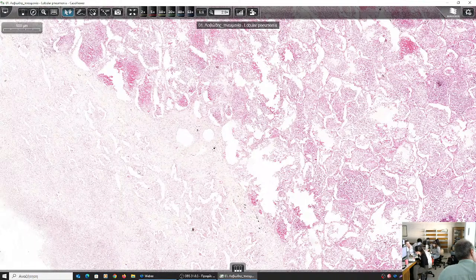Who caused this? The macrophages, because they secrete the fibrogenic factors, mainly transforming growth factor beta. So now that we have scar formation, that means desmoplastic reaction, and finally the cellular component is diminished and we have just collagen, that means scar. So what does this mean for the duration of the inflammatory process? What does desmoplastic reaction and scarring tell us about the duration of the inflammation? It's been chronic. This is chronic inflammation.